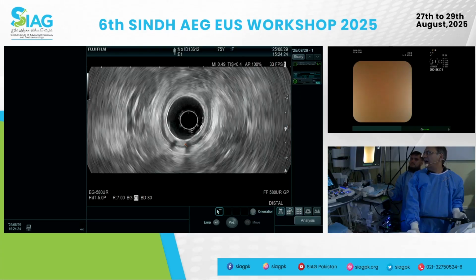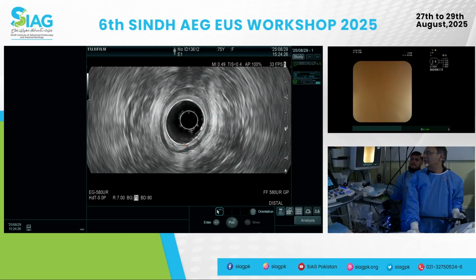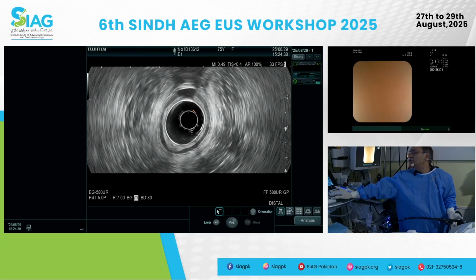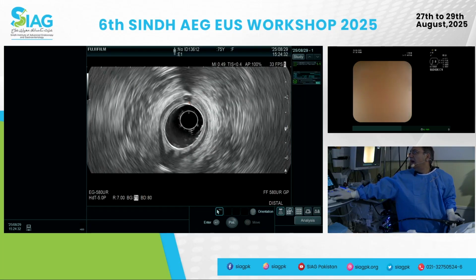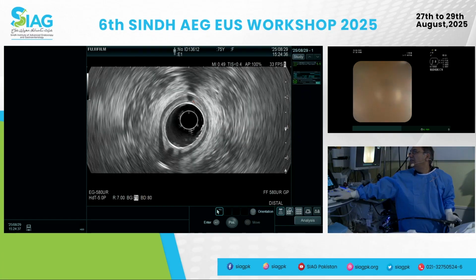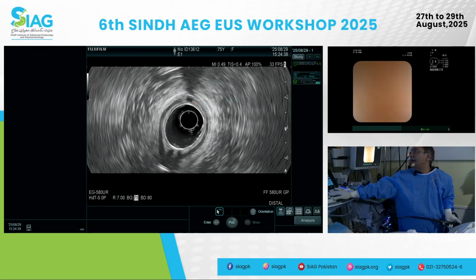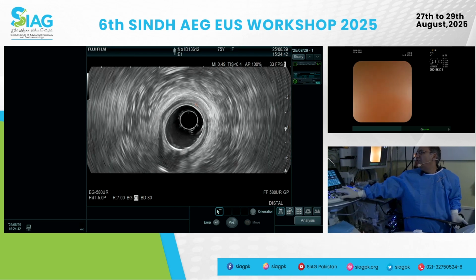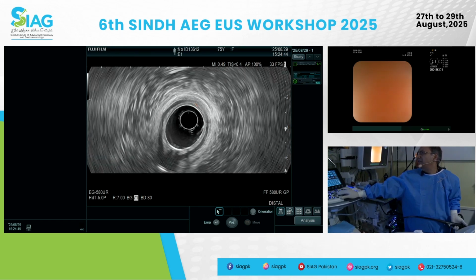Sometimes in fecal incontinence, you might see a break in the muscle, and usually that break is going to be in females who have given childbirth. It may be a breakage on the anterior side, especially in those forceps assisted deliveries.